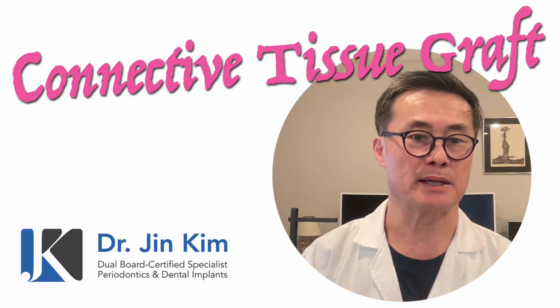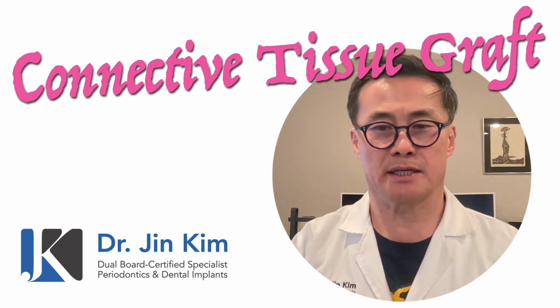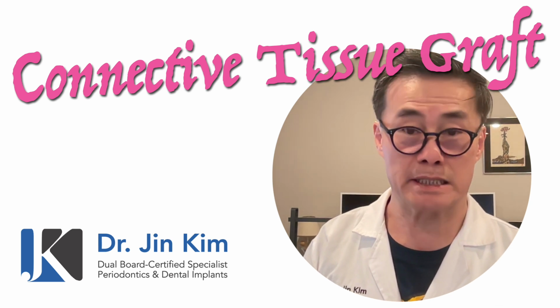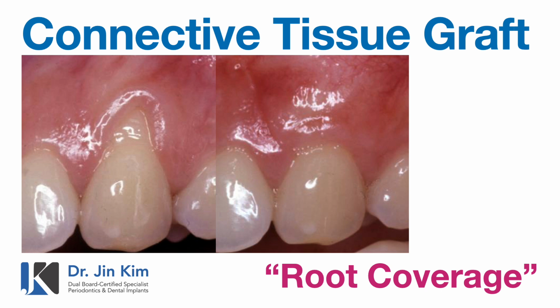Today I'm going to talk about the connective tissue graft. A connective tissue graft is something that a very typical periodontist would be doing in a very routine manner. It is one of the many procedures that try to cover the root surface that's exposed, try to thicken the tissue around dental implants or teeth, or there are a number of different applications of this very convenient method in soft tissue plastic surgery.